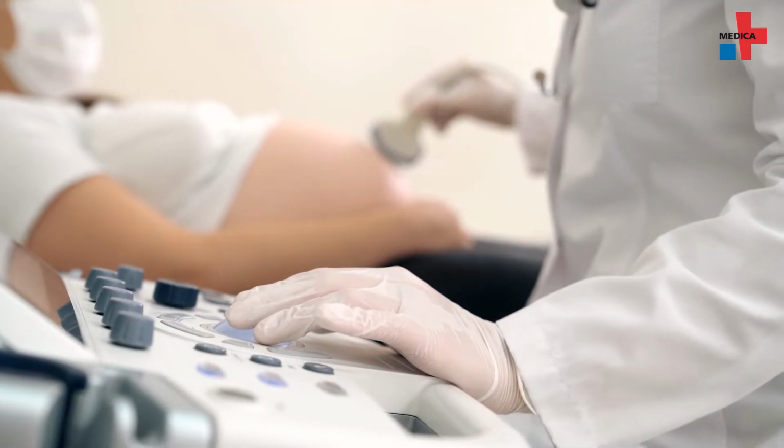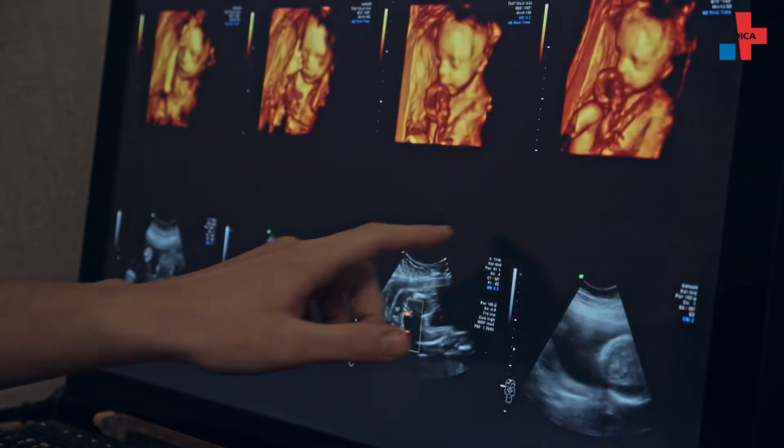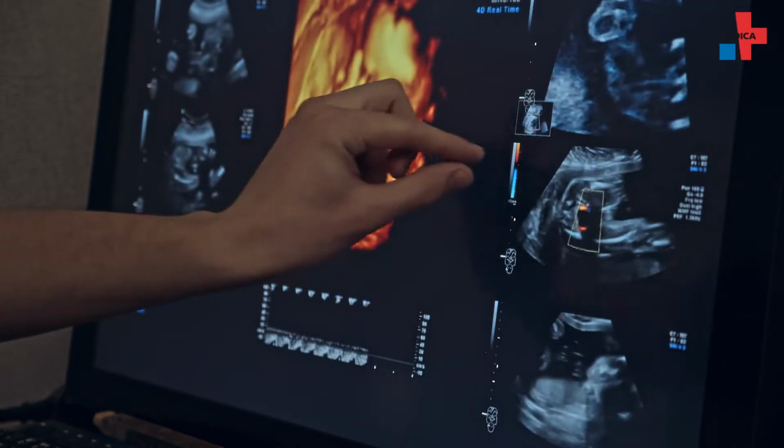The third project concerns the interdisciplinary co-work with the team of the gynecology here at the University Hospital of Bonn. We work closely together and we have an interdisciplinary outpatient clinic for rheumatic women who are pregnant. And due to this cooperation, we were able to design phantoms of fetuses in order to simulate the pathology and normal ultrasound findings in order to train medical students as well as young doctors for early diagnosis of pathology.